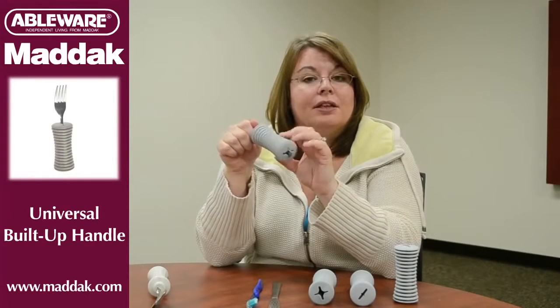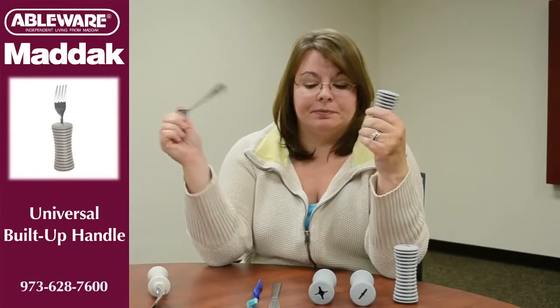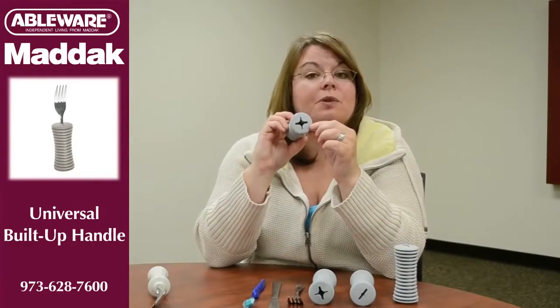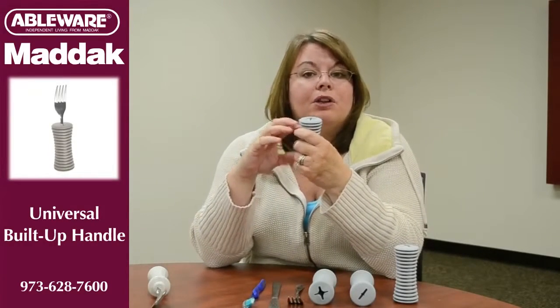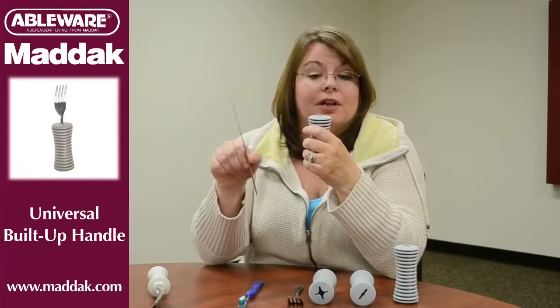To remove it, you just reverse the process: slide it back through the handle, twist it, and then pull it out of the handle. To use the universal handle with a knife, you start with the star-shaped end. Of course, we don't want you to use it with any knives that are going to penetrate the skin.